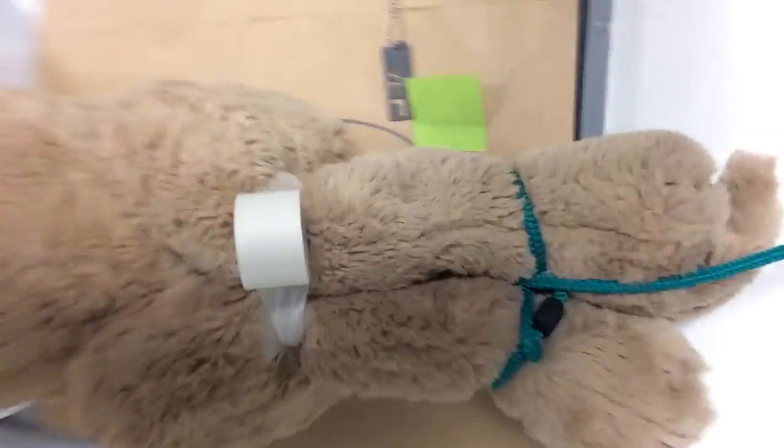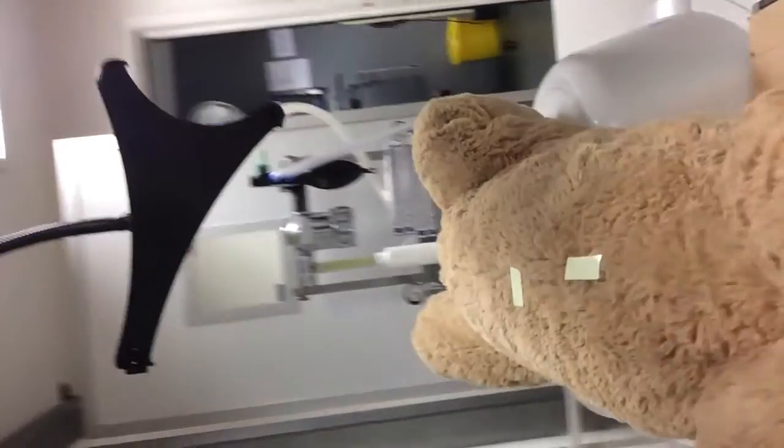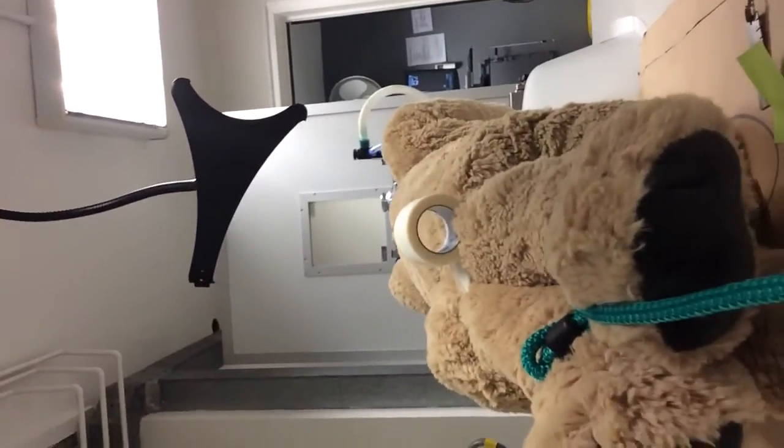This is the left, so I've done the left. Now I'm going to turn the light on and move the camera so you can actually see the patient as a whole — nose to tail, paws up to patient, and then here at the time.